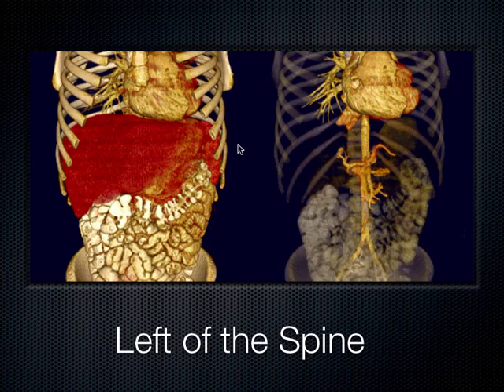This is a really cool CT scan, 3D renderization with the organs on, with the organs off. Very cool technology, I agree. The cost of 500 chest x-rays and radiation. Here is the aorta coming down the left side of the body, correct? Here's the heart. So after it comes out of the chest into the abdomen, that's when you can see it. You can't see it up here in the chest with ultrasound. That's one of the limitations of ultrasound. You can't see a thoracic aorta, but you can see abdominal aorta very, very easily. You just keep pushing down until the spine shadow comes into play.